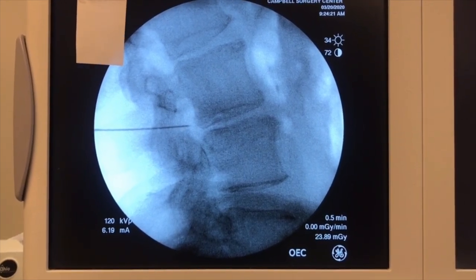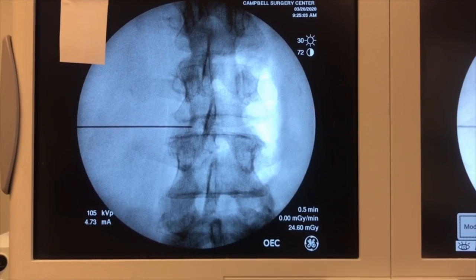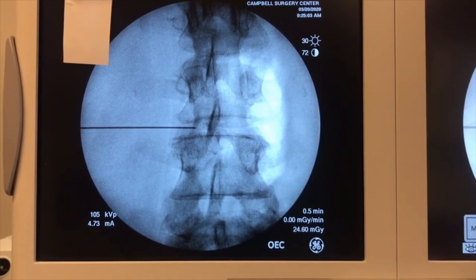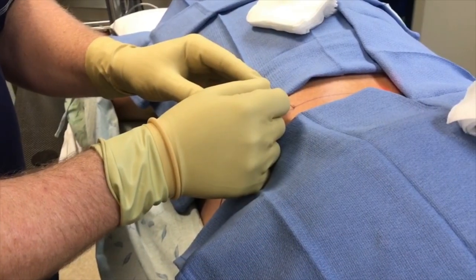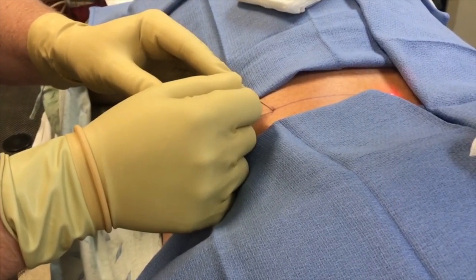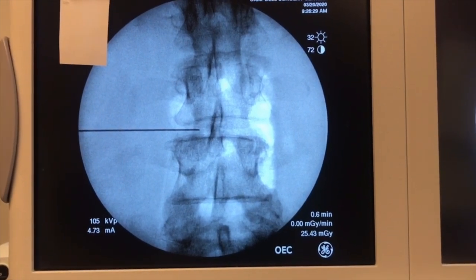On the lateral view I'm in the foramen, but I need to check my AP to see how medial I am. Under the AP view I'm basically at the medial pedicle line — the traversing root is just medial to this. For a posterolateral herniation, you could advance this easily ventral to the traversing nerve root, so when you put your endoscope in you're staring up at the inner surface of the root looking directly at the disc herniation. At this point I advance the needle until I feel the slightest resistance — I want to just touch the annulus without puncturing it.